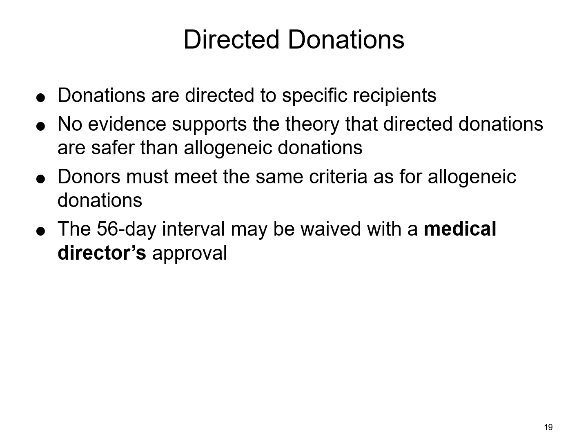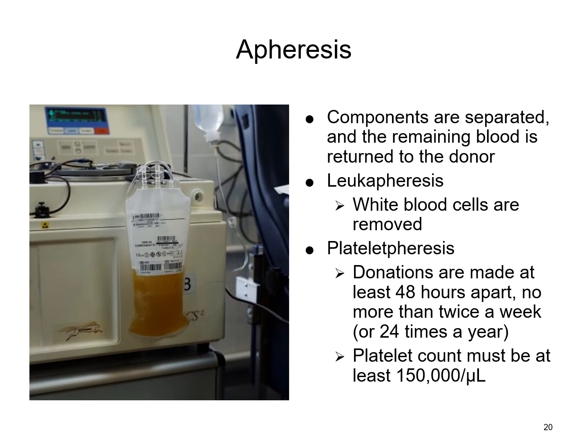Depending on the recipient's needs would depend on how often that donor is allowed. But usually these are the situations in which you use directed donors. So apheresis is a pretty cool process. What it does is allow you to remove from the donor just the product that you want, and then the rest of the product, the red cells or whatever, would go back into the donor.